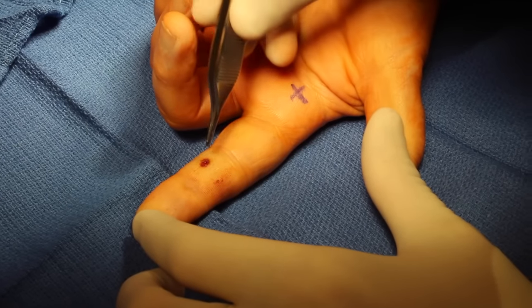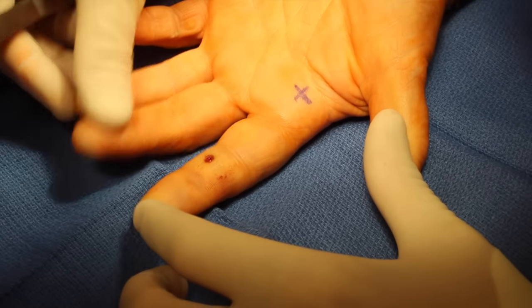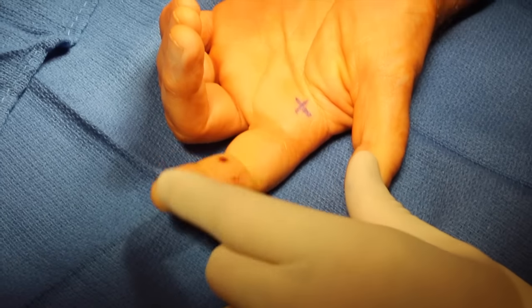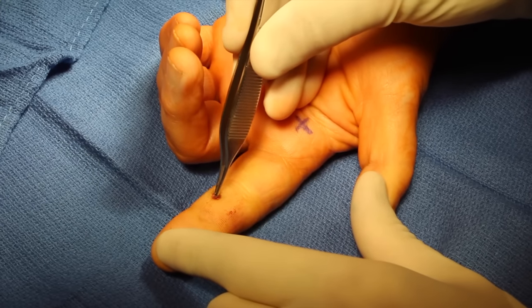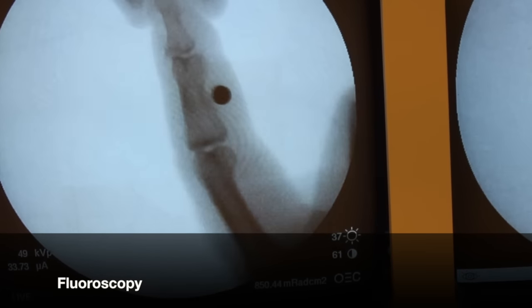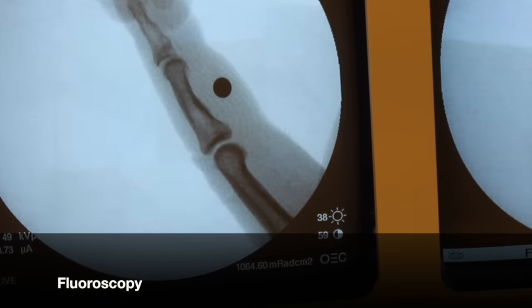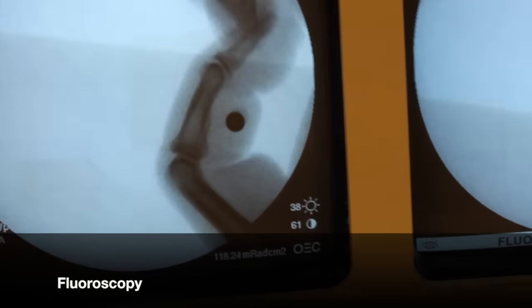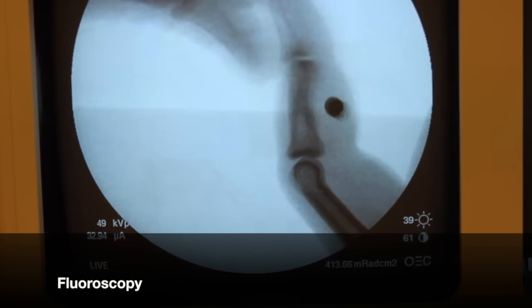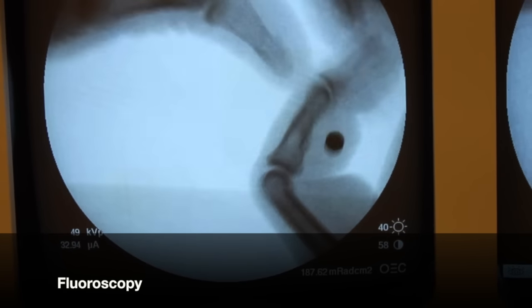Here is the entry to the BB right over the flexor tendon apparatus, and as you can see, there's a mass effect of the BB. It won't let the DIP come down into flexion. Here's fluoroscopy of the BB in the finger, and as you can see, it's suspended above the flexor tendon apparatus. However, it still may have impacted the flexor tendon sheath, and you can see how the mass effect impedes DIP flexion.